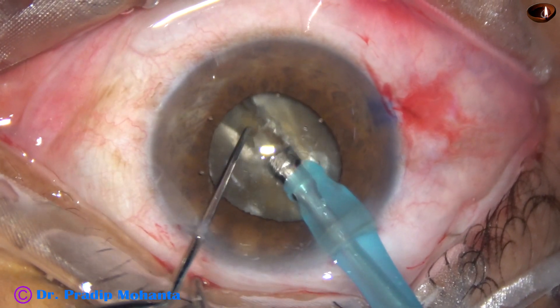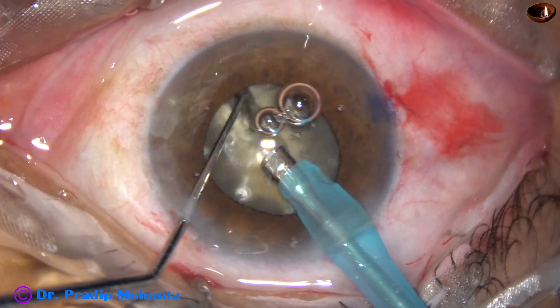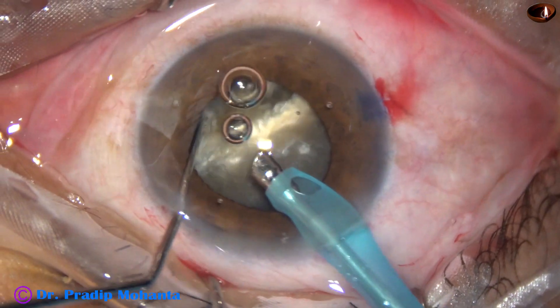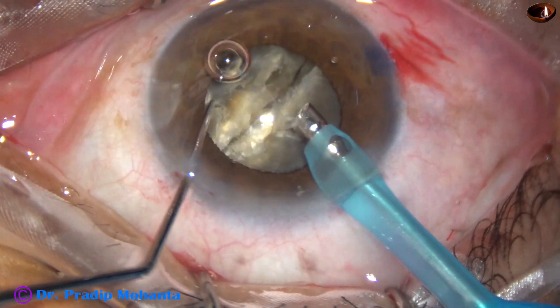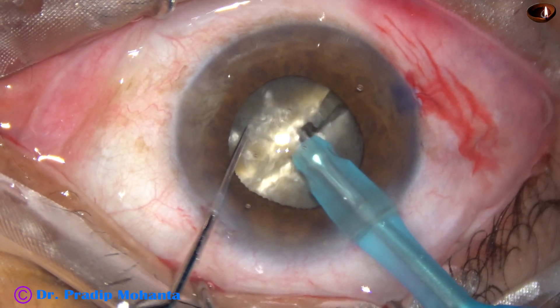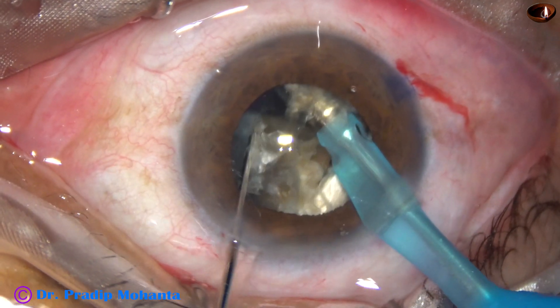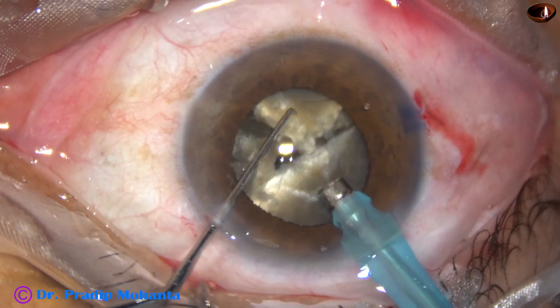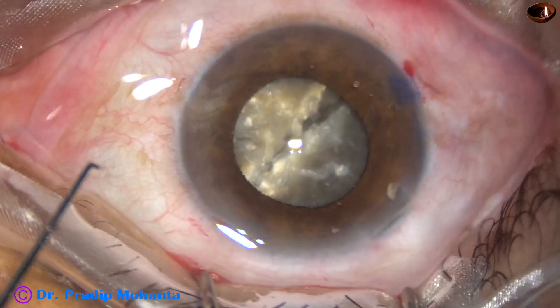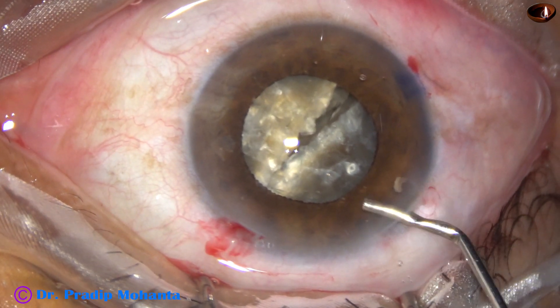The nucleus has been divided into almost equal halves. Now each hemi-nucleus is to be divided into two fragments. But see what has happened — the pupil which was very nicely dilated has started constricting. I am worried because the cataract is very hard. If the cataract is not so hard, we can manage with a small pupil. But when the cataract is so hard and there is intraoperative miosis, I am a little worried.